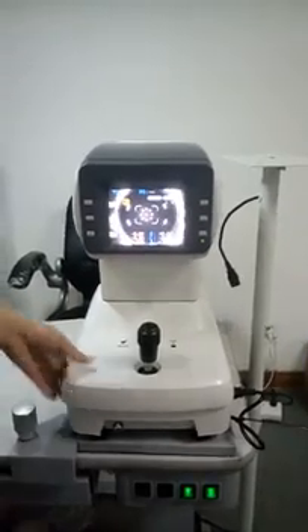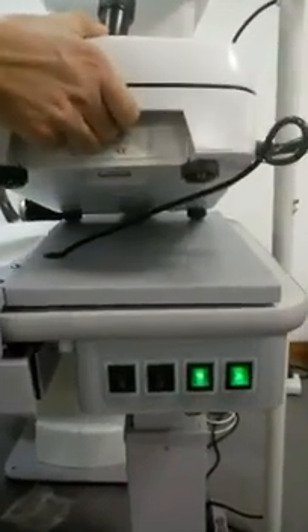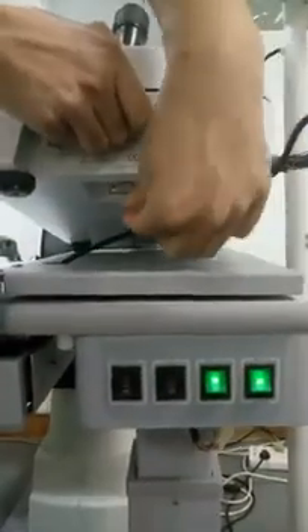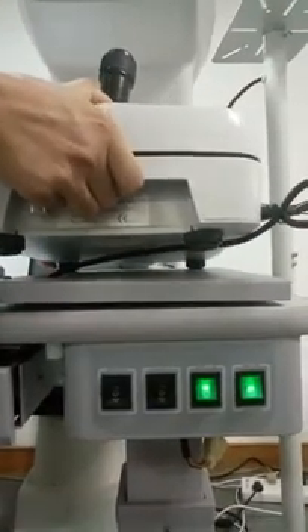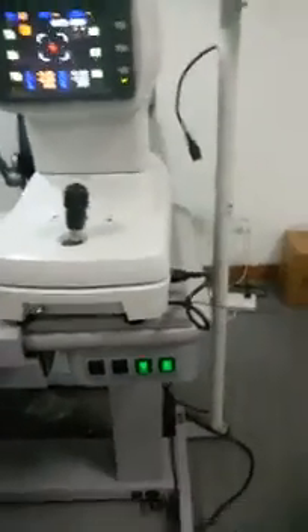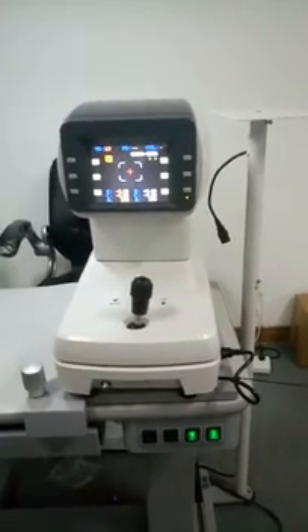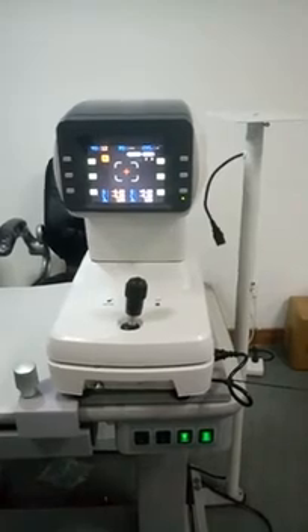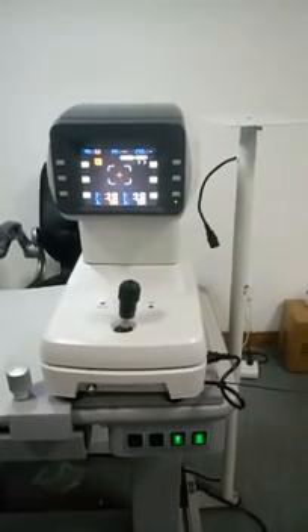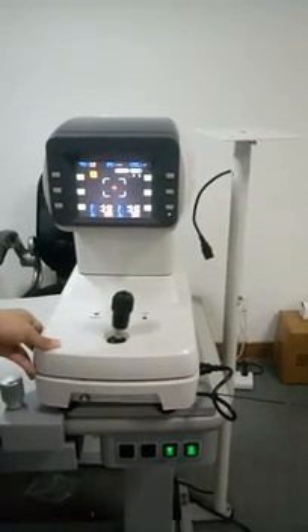The key advantage is it has a Bluetooth interface underneath the machine. You can add a Bluetooth device and connect it to the CV 7600 auto refractor for data exchange, using them together with the CV 7000/60.